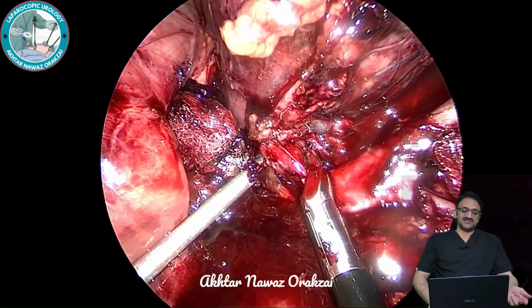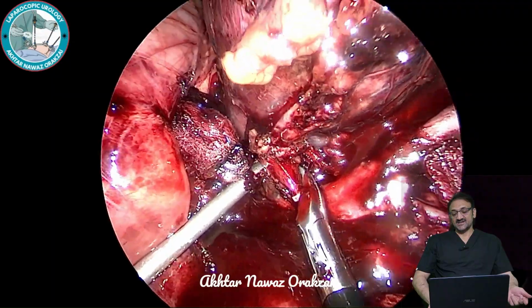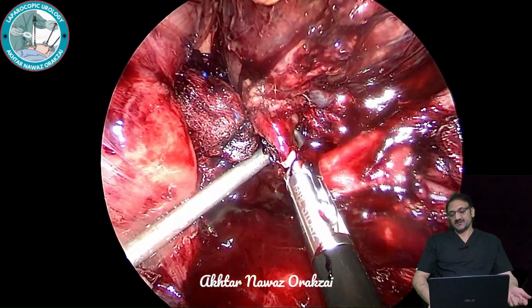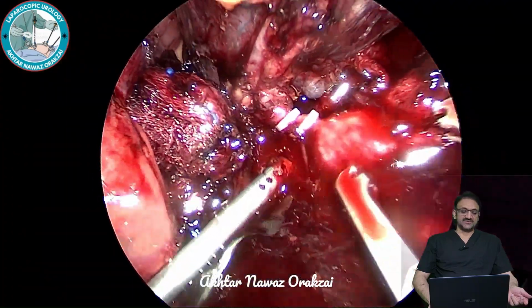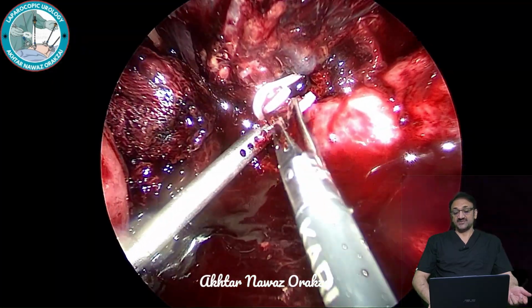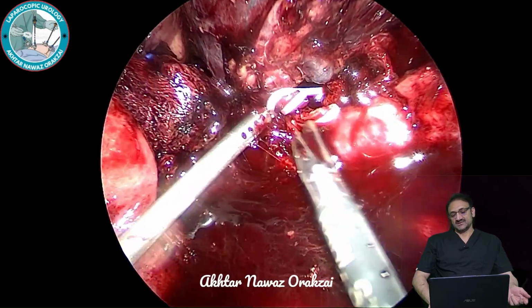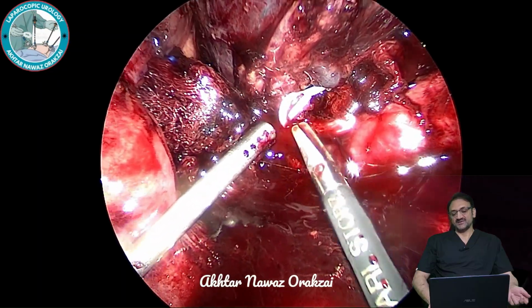So again, dissecting around that portion so that another clip is applied towards the gland, and then we'll be cutting it. Here I'm touching the forceps again, and now we have applied another clip, and now we are cutting. I tried to apply the third clip, but it was not possible, so we left it there. So the renal vein has been detached from the adrenal vein.